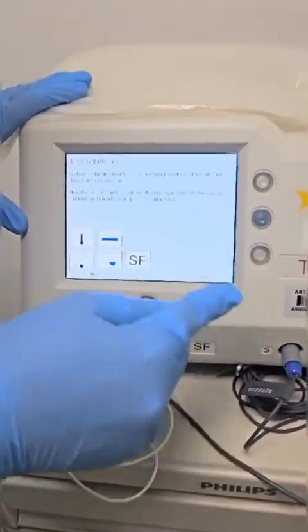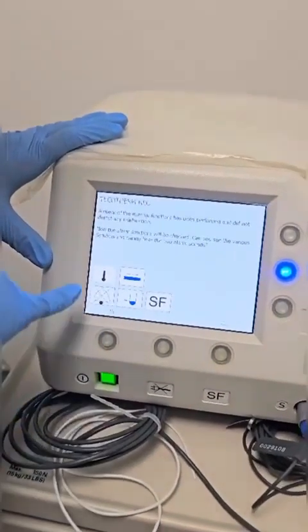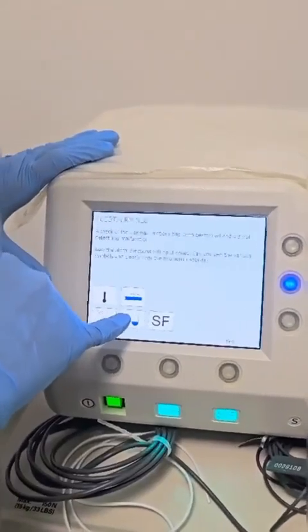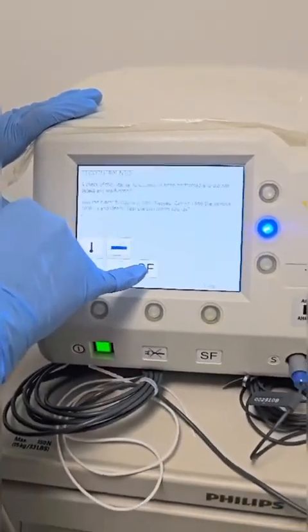All these icons are going to be shown on screen in case they are present: temperature, a kink in the hose, alarm silence, flow of water, and system failure.